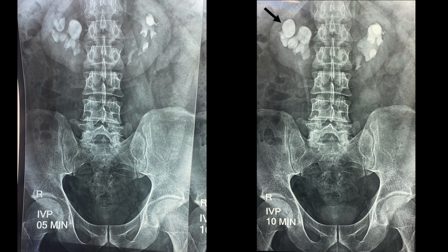The subsequent excretory films of IVP give us a lot of data related to the orientation of the calyces. The image on the left side is a five-minute IVP film where you can see lateral to the calculus multiple calyces. However, on the subsequent IVP film at 10 minutes, as pointed by an arrow, you can see another bright calyx which is seen slightly medial compared to the other calyces.